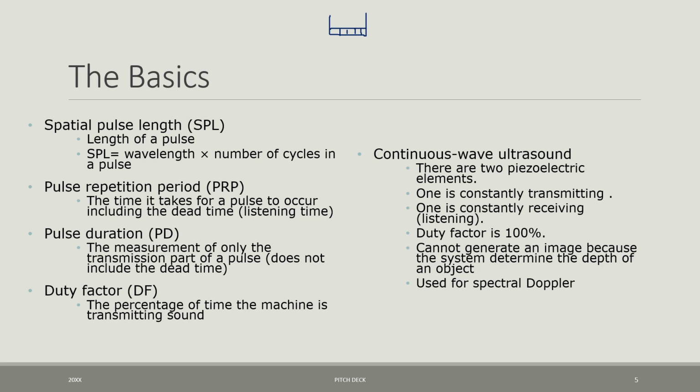Now, Principle 1 of ultrasound says that this is the typical principle that most ultrasound machines operate off of. And the idea behind this principle is that it will release a pulse of probably about 2 to 3 cycles of sound. And it will wait for that pulse to go as deep as it wants it to go and return, and then collect that information before it emits another pulse. And so when we're studying ultrasound, we really look at the pulses as a packet or an individual unit.